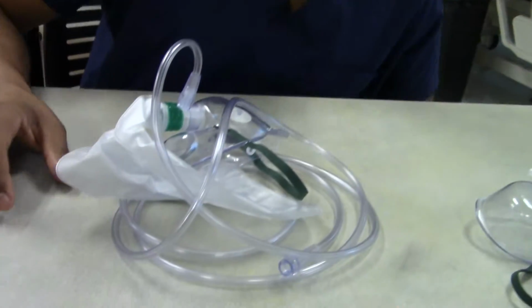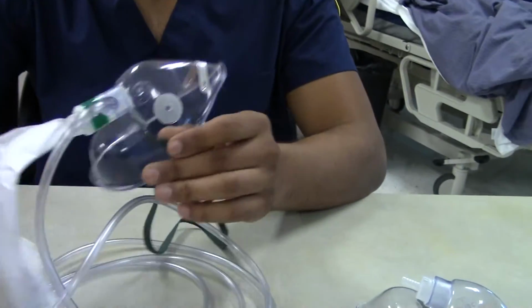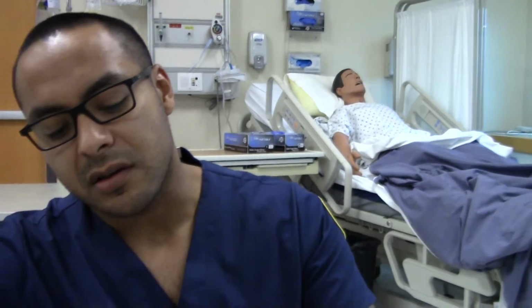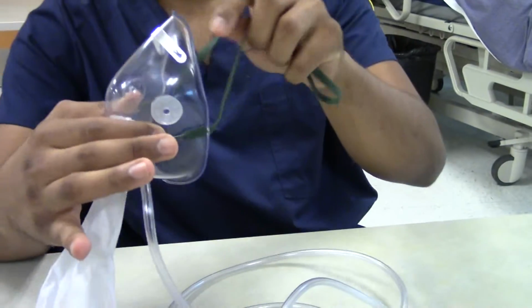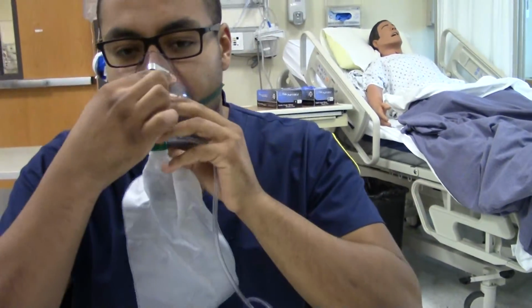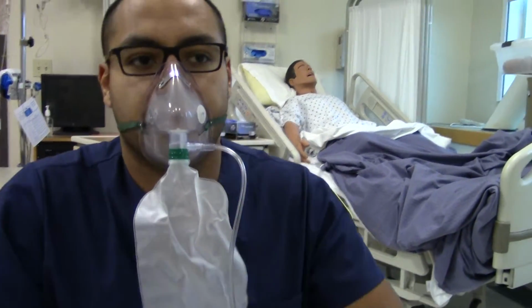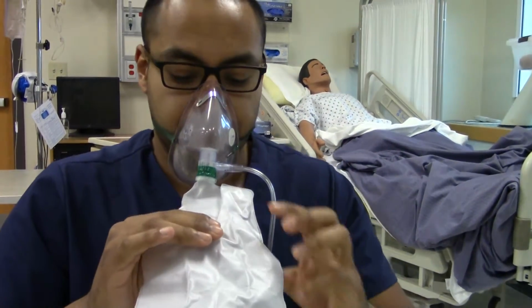Alright, this is the partial rebreather and the non-rebreather. Partial rebreather has a FiO2 of 40 to 70% and a flow rate above 10. Anything below 10 will deflate the bag. Put it on the same way, with the middle frame to make the mask more tight around the patient. This is a good mask here.